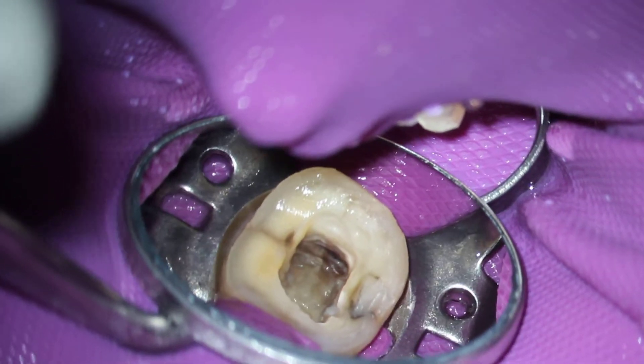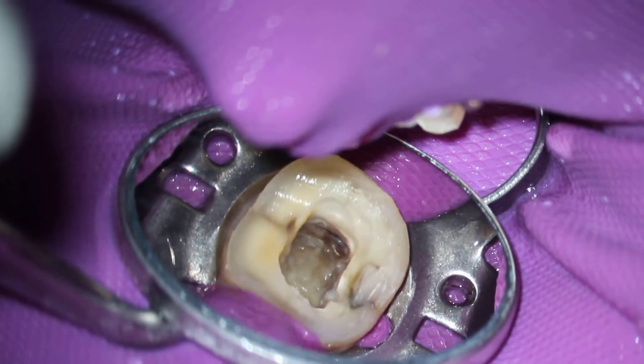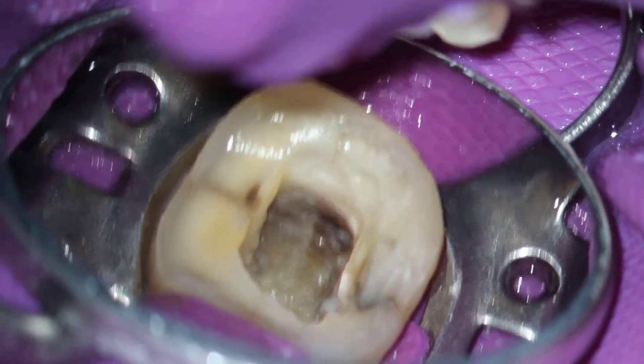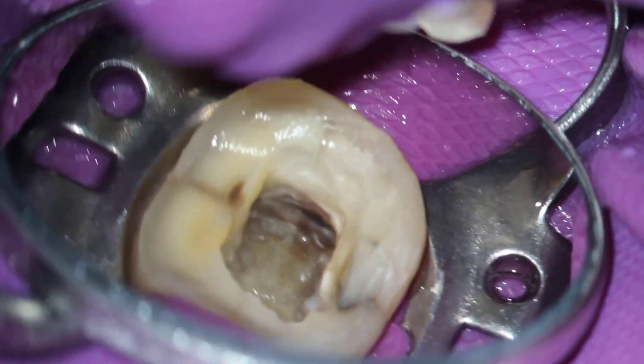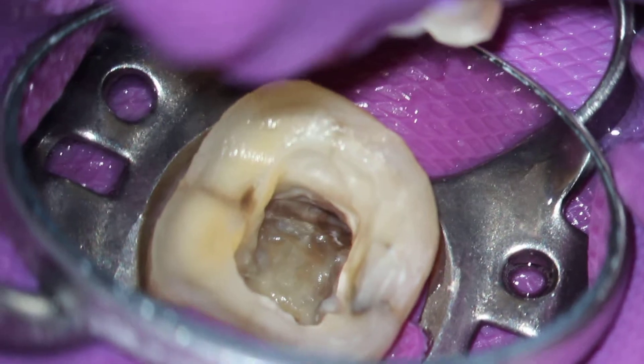We're starting out at about 4 power, looking down the distal canals of tooth number 30. We're going to increase to about 6 power. I've left a little bit of RC prep in the canal so that you can see the two distinct roots and kind of a dumbbell shape there.